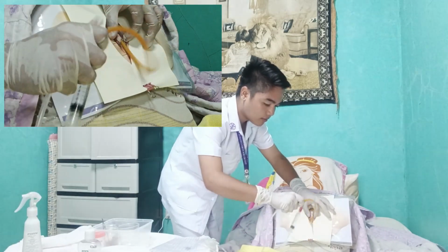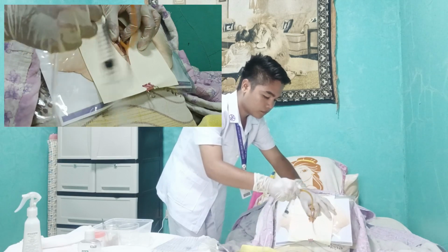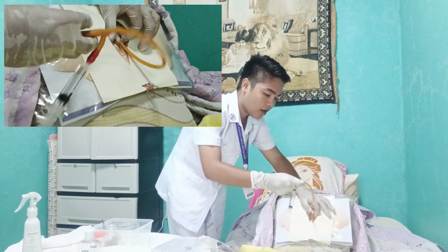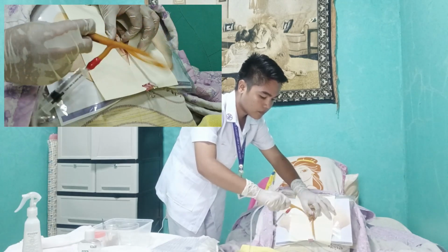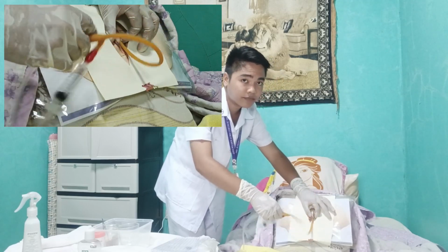Using one hand, properly tuck it. Okay, it's properly tucked.